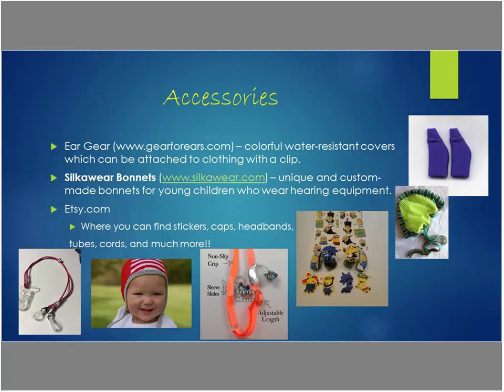There's the Silkaware bonnets, the unique and custom-made bonnets for young children who wear hearing equipment. And of course, you can go on Etsy.com where you can find tons of stickers that you can put on the actual hearing aid, little clips that go over the mold. You can find caps, headbands. You can change the tubes to different colors, different cords, and much, much more.